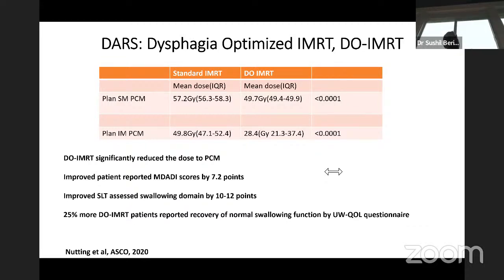You still have dose heterogeneity in your CTV, and you try to limit your 105 in the CTV, not in your PTV and organ at risk. But the dose heterogeneity has gone down. In the past, 105 used to be like 70%, 80%. Now with the modern day planning, it's a bit more homogeneous dose efficient. And 105 is more close to 15, 20%. And 110 is close to 0. So things have changed in terms of planning. But when you start these patients on the plan and you have more than a centimeter mismatch with your SSD, then you should reconsider rescanning and replanning the patient to avoid overdose or underdose of the target or the OAR. It's important to be able to see that on your cone beam CT or on your setup on a day-to-day basis.